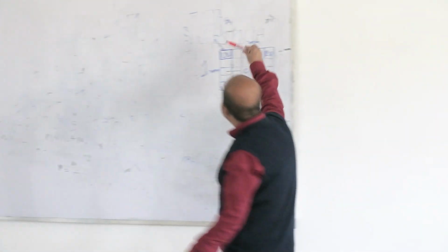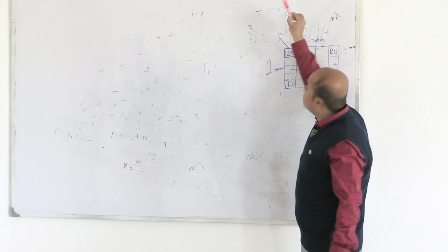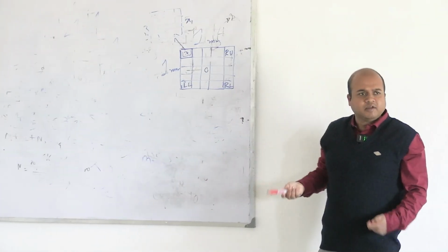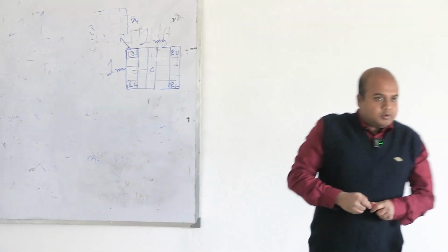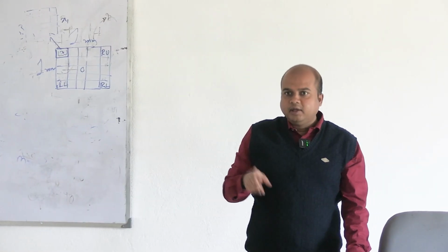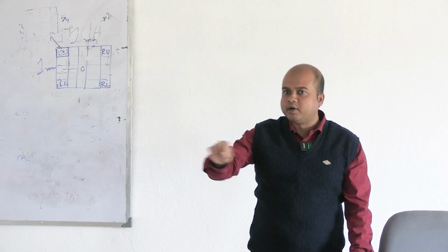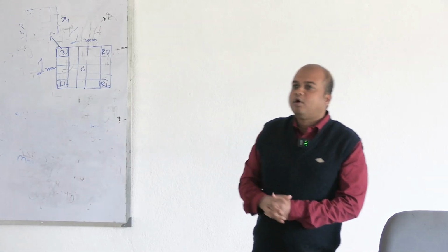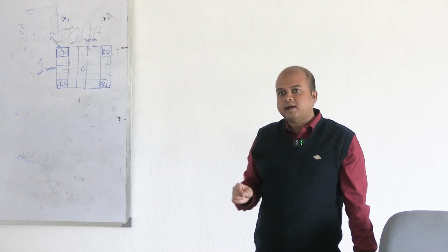So, the more cells you count, the more accurate is the answer. So, cells will be there in here also. So, count it at the last and mark it as x1. This x1 is of the left upper square, or you can write x left upper, whatever. But if you write x1 in answer scripts, mention what x1 is. x1 is the number of cells in the left upper medium square, or x left upper also. These are not standard terms. So, whatever you write, that has to be explained.